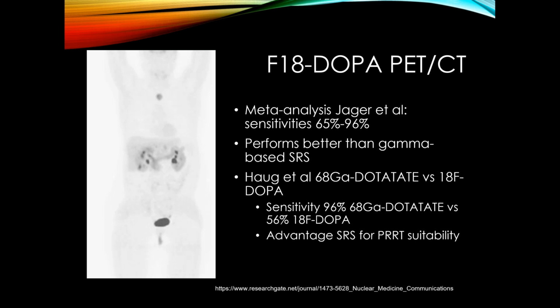Okay, but are you hearing anything on the copper scans in terms of their quality, and are they better than gallium-68? Do you have any sense that you could comment on at this stage? No, I don't. Most people are quite happy with the Dotatate, so I'm not familiar with the advantages over Dotatate at this point.